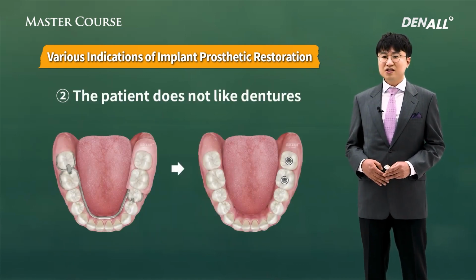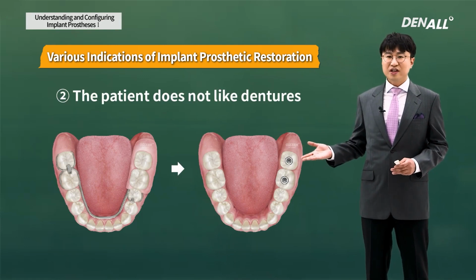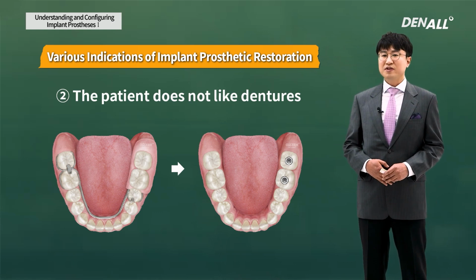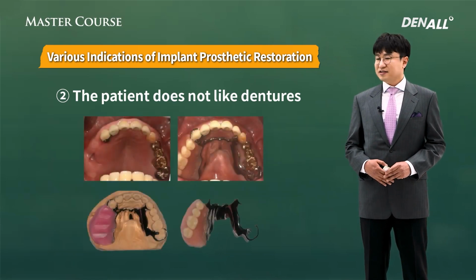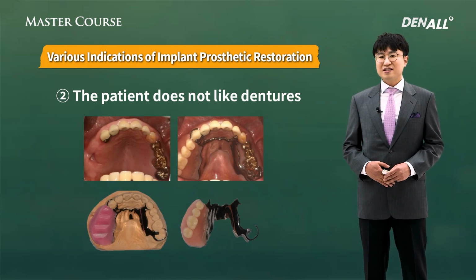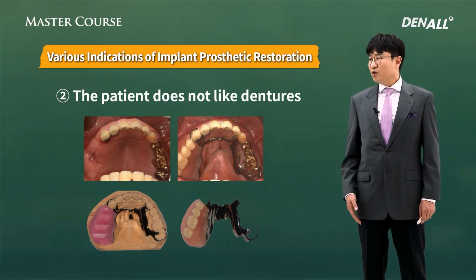But due to financial means, sometimes people want a steel denture, and especially in Korea, dentures are covered by health insurance. Of course, it's an option you have to consider. I recommended an implant with sinus grafting, but he didn't want to do grafting, so he opted for a denture, but he wasn't satisfied. So in the end, he opted for implant restoration.